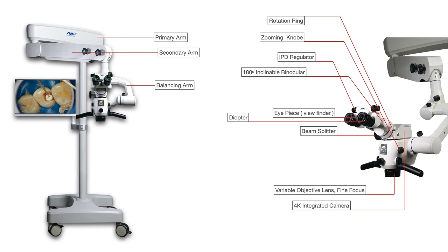And the objective lens: you should have a high number, because the objective lens is the tool that captures the image, and it should have enough space to take a picture of the patient. I will show you now more detail about that.